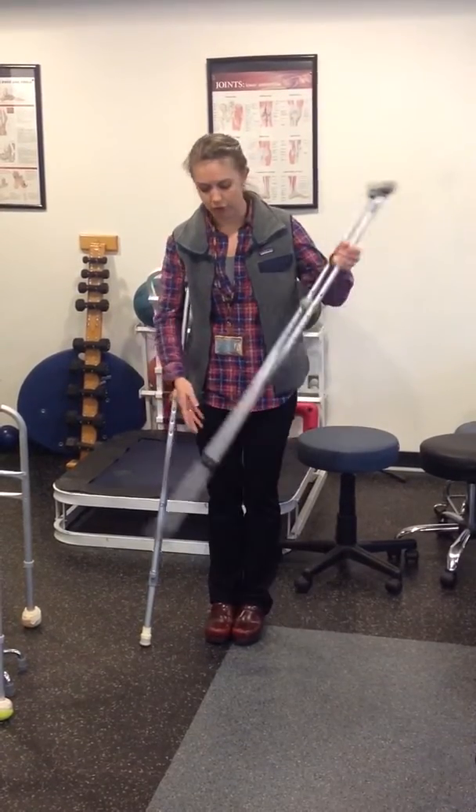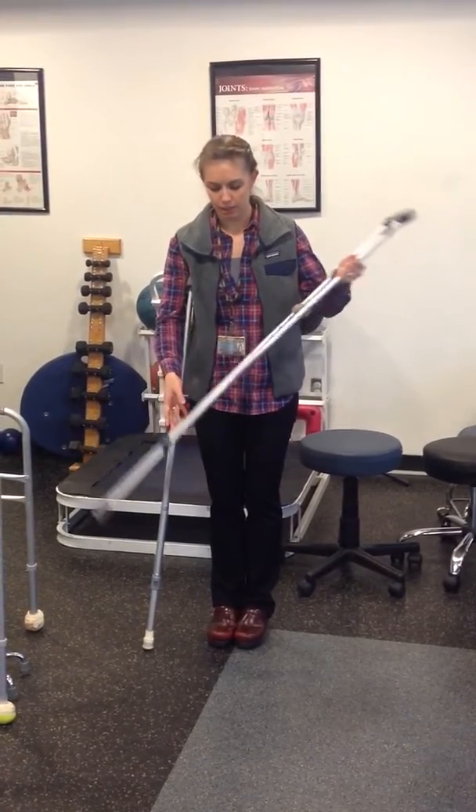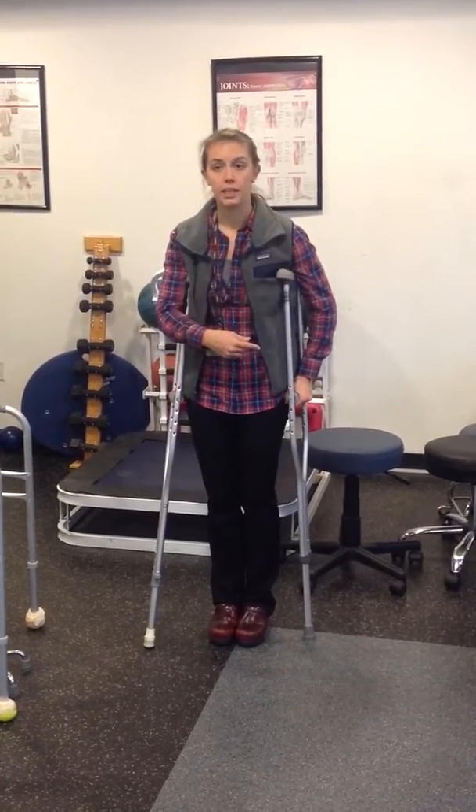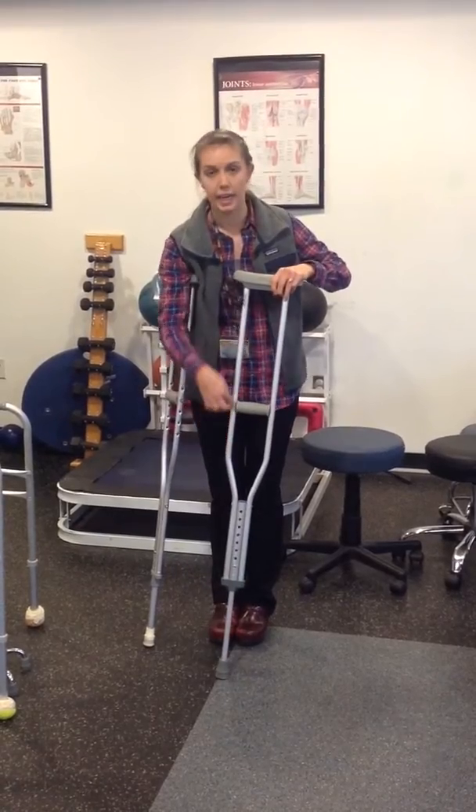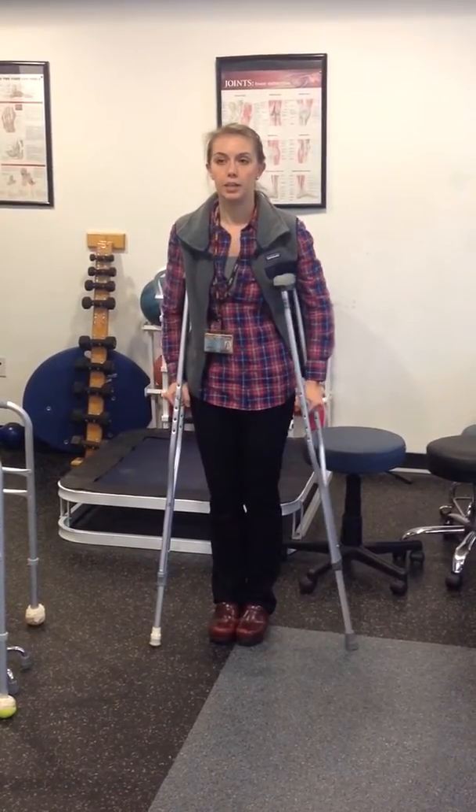You're able to adjust the height down here to make it the appropriate height. If you don't have the appropriate bend in your elbow, you can also adjust here — just remove these and slide it up and down so that you have the right bend.